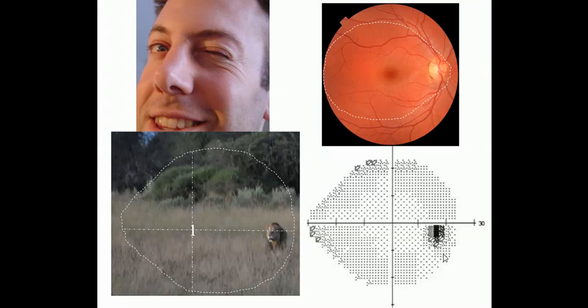Okay, so let's say that the person's focusing on something in the location of this number 1 spot. They think that they see an interesting bird or bug there, so they're looking there. So where will those light rays fall? They'll enter the eye and fall on the fovea. And where does that correspond to on our visual field? That corresponds to the center. Let's take another spot over here in the picture. Let's say that there's what's going on over here. Where's that stimulating the retina?